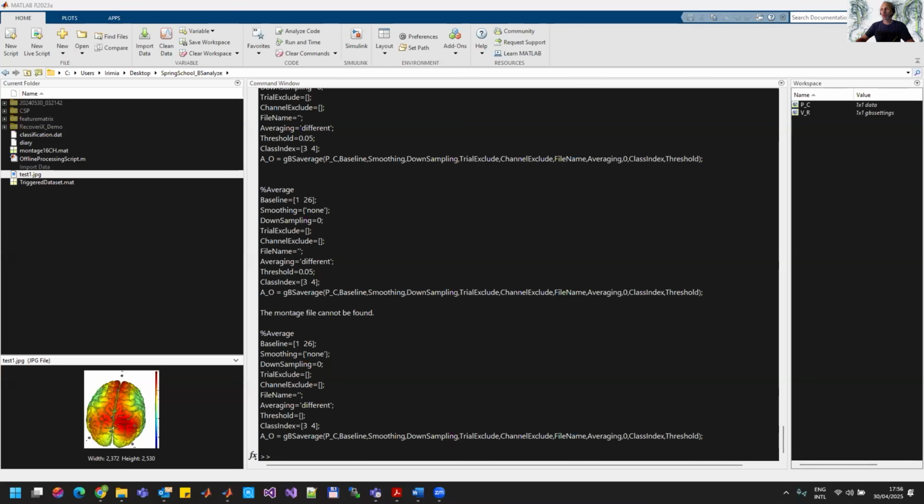Federico is asking, you are doing motor imagery, but you could also observe somebody moving the hand. What would you analyze? I would analyze exactly the same things, because when seeing someone else's hand moving, you get almost the same activation on C3 or C4, on the cortex projection of the hands.